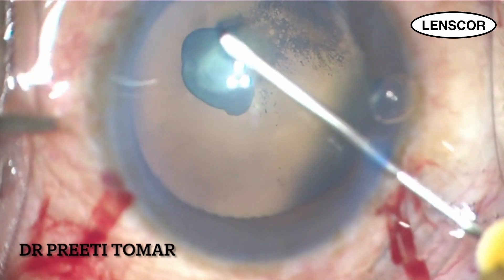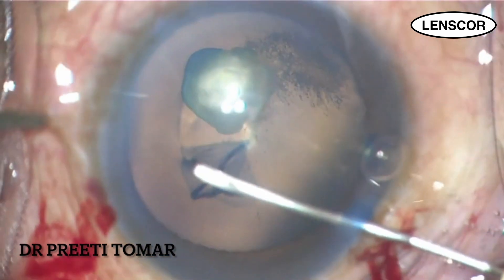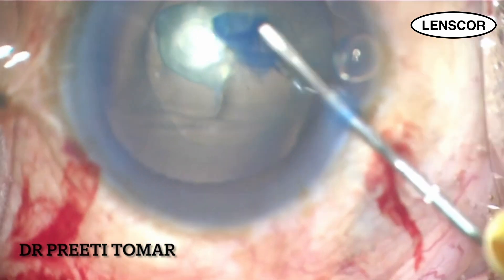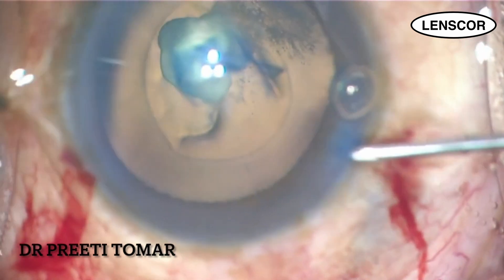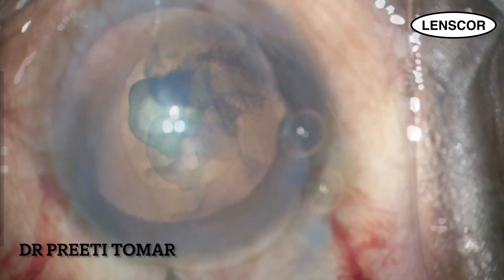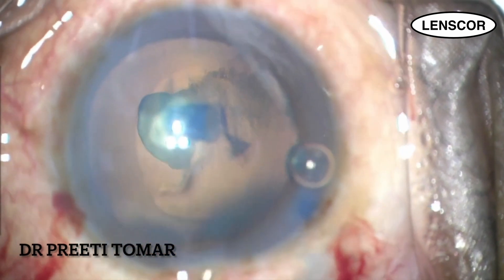I am aiming for a 5mm rhexis, being mindful of the possible posterior capsular tear and the need for good sulcus support and optic capture for the intraocular lens in those circumstances. A 2.2mm incision is made. The surgical principles to be remembered in such cases are low flow, low pressure dynamics in your phaco machine.